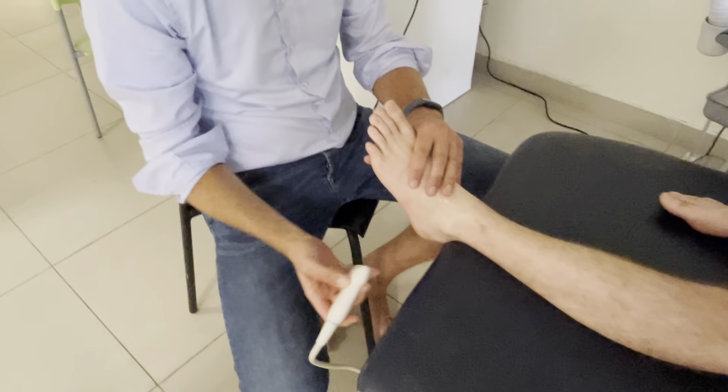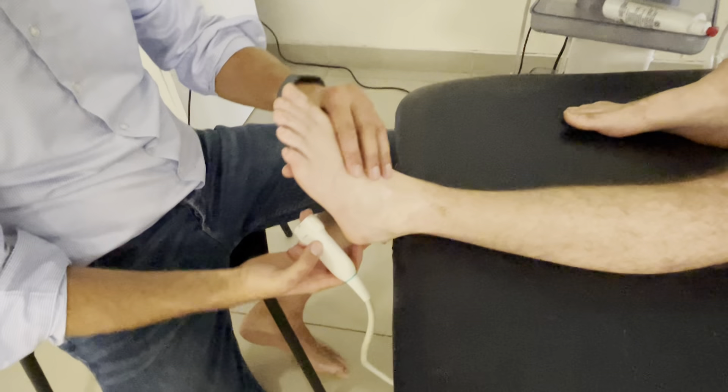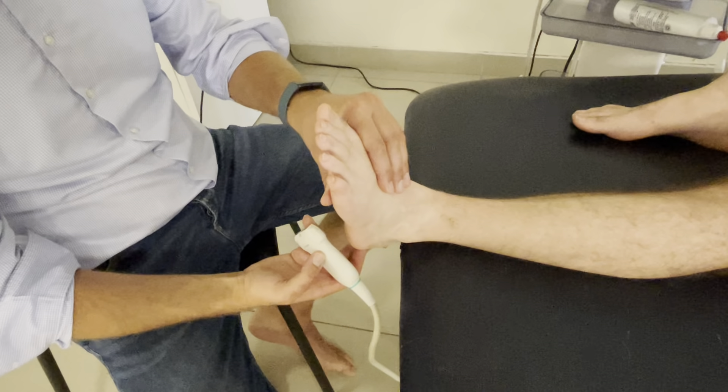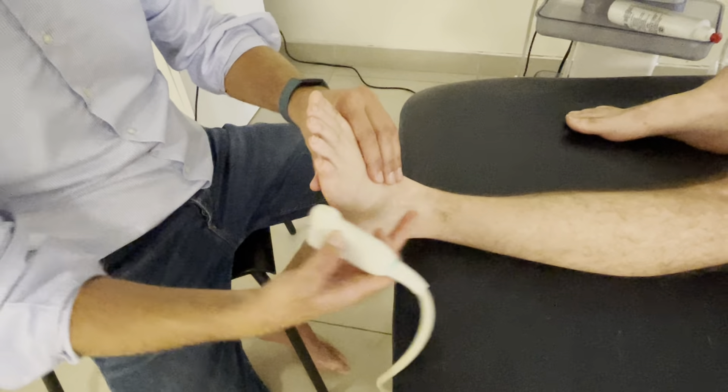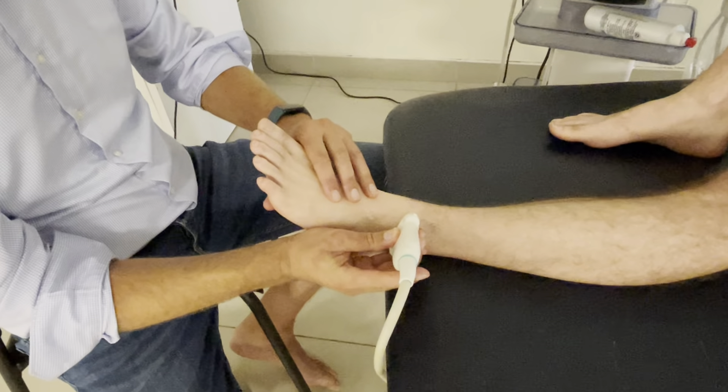As a dynamic test for the syndesmosis, we can do a dorsiflexion-exorotation movement, because this is the actual injury mechanism that can create a tear. So we're going to scan the ligament and make an image like this.